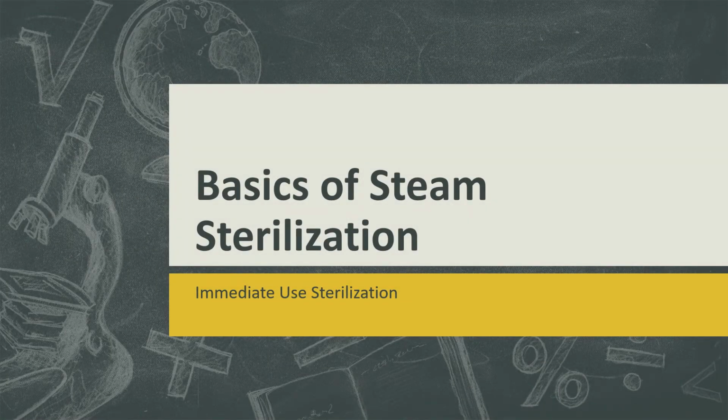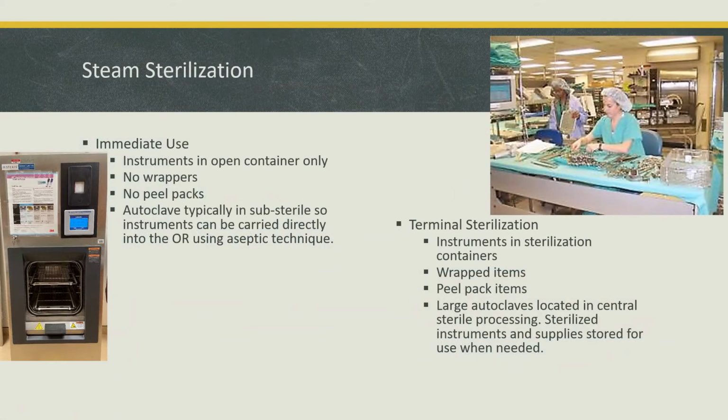Hello. Today we're going to talk about the basics of steam sterilization and how that relates to immediate use sterilization. Let's just talk a little bit about the different scenarios you're going to see in the OR.